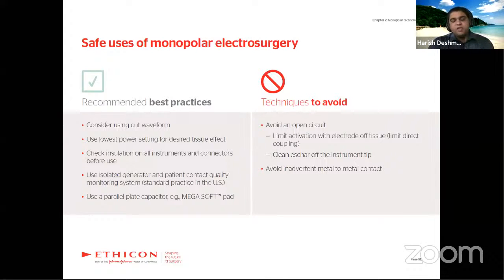So if it is kept near any other instrument, like the harmonic or the anesthesia machines, it will show you abrupt readings, or it can affect the overall performance of the device. So all ESUs should be kept separately, isolated, with a minimum of 1 to 2 feet of distance between the machines.